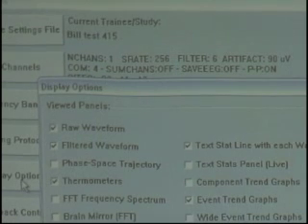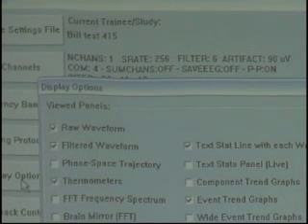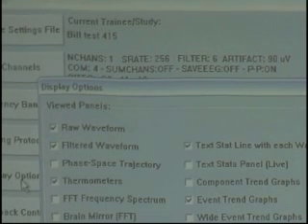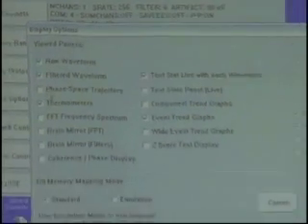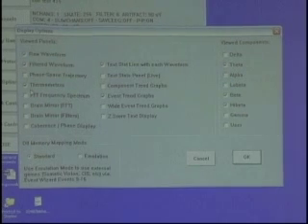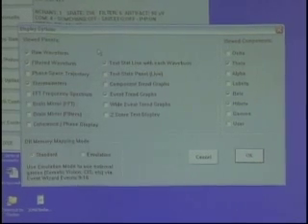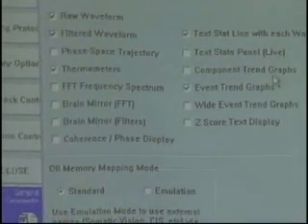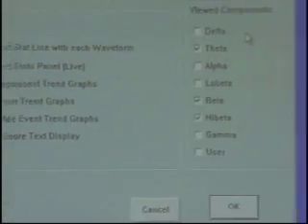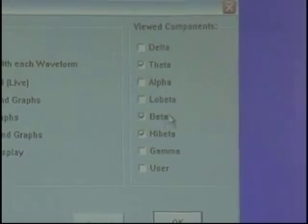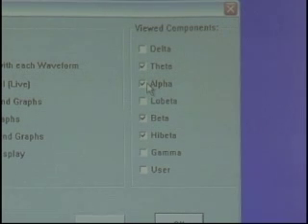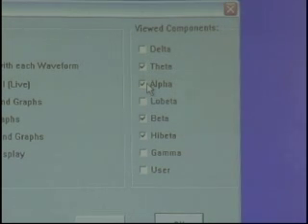This covers display options — what you want to see on the training screen when you start. The good thing is all of these panels can be turned on and off live from the training screen: raw wave, filtered, thermometers, and so on. This just lets you pre-check specific things so they come up each time. Also, under viewed components, this protocol is training theta, beta, and high beta, but you can turn on other components like alpha for viewing purposes even though they're set to ignore.